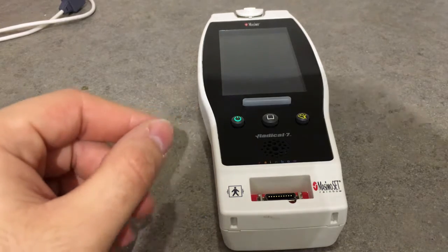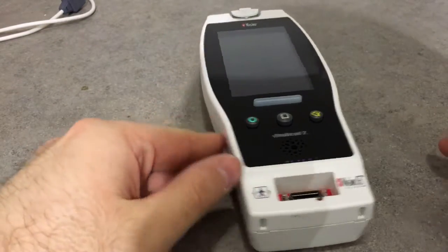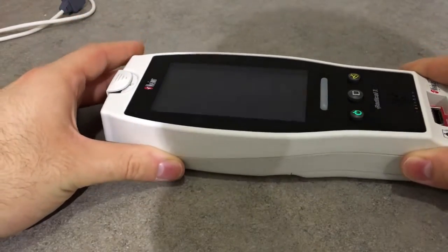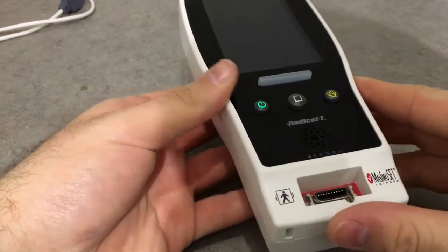This is very useful with patients that are moving. That's a very good feature of this pulse oximeter.